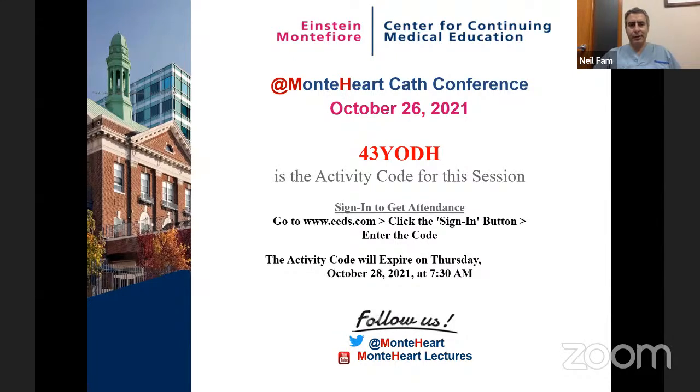So I do find that the XTW distributes the forces, leads to a more robust tissue bridge, and I think anecdotally there's less SLDA with a W. So whenever possible, we're using a W. Now, I do find that sometimes it's too wide to get between the cords and grasp the free edge of the leaflet. And so if it's clear that the leaflet's folding and not going into the center of the clip, then we will switch to an XT.